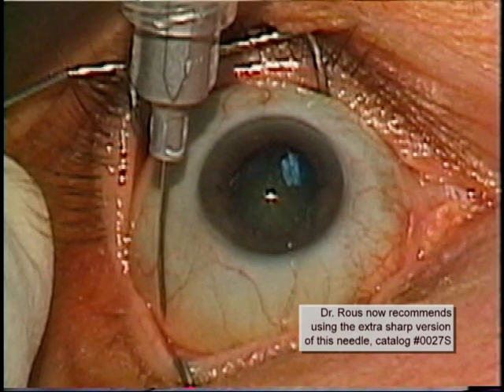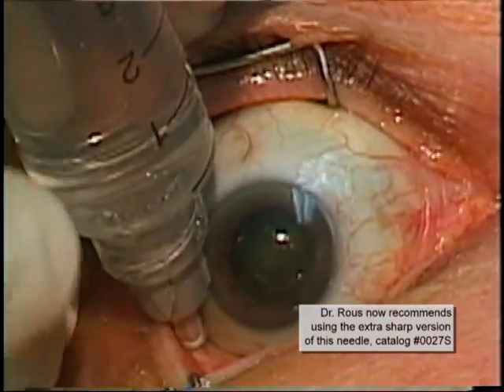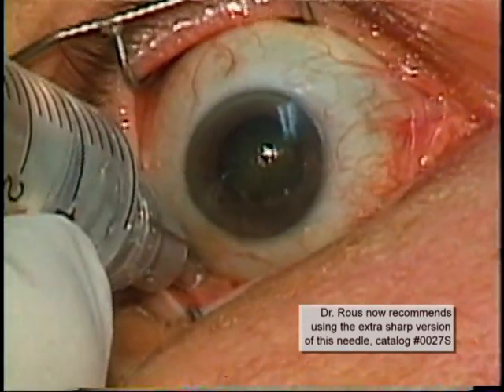Notice that a wire speculum has been inserted for better exposure. Here we see the PSI ICO sub-Tenon's needle, which is now ready to penetrate conjunctiva and Tenon's in a tangential plane about ten millimeters from the limbus in the inferotemporal quadrant. The needle easily passes around the globe until the hub of the needle touches the conjunctiva.